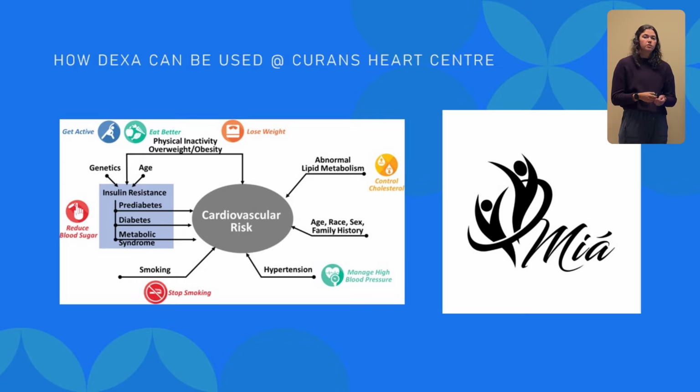We also want to use it within our lifestyle programs such as the Motion and Action exercise program, where we can use DEXA-derived measures to track changes to someone's body composition over time and potentially evaluate the risk of developing other metabolic diseases like diabetes, for example.